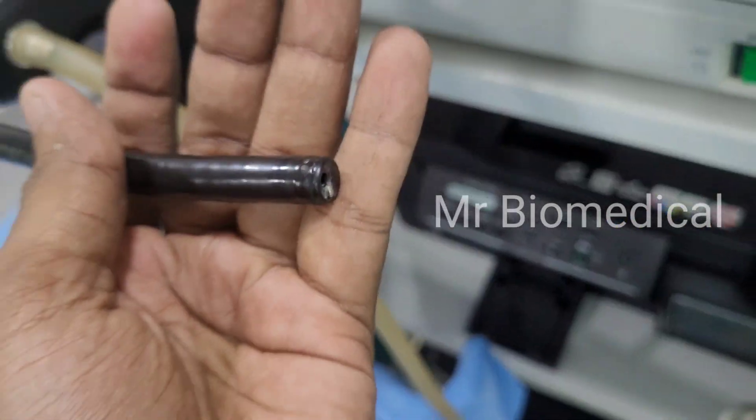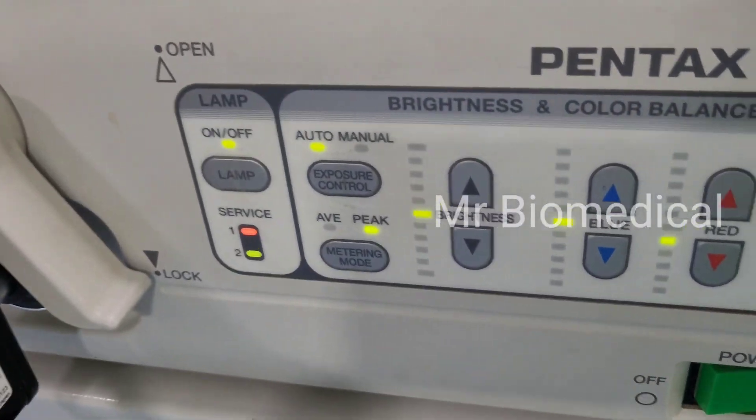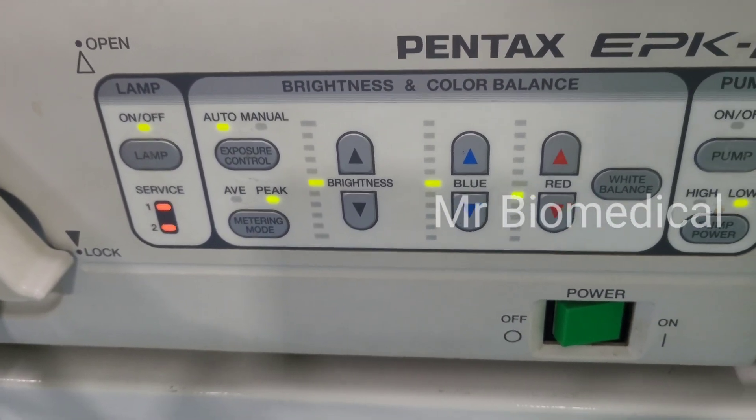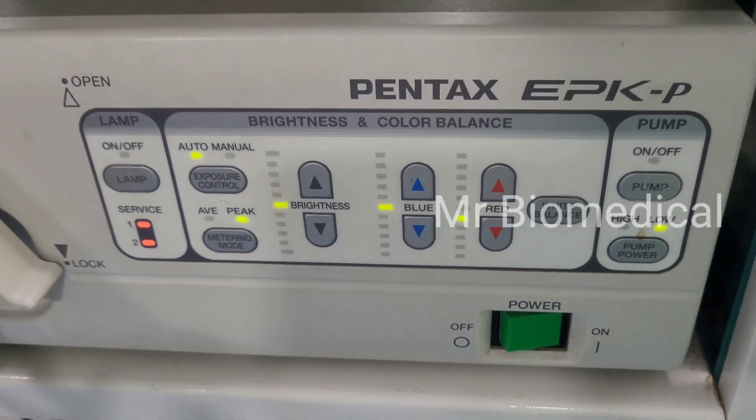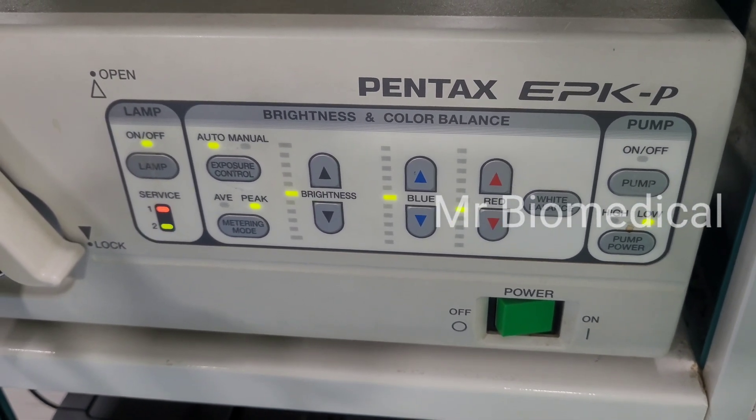This is the tip of the endoscope and the light is not coming, but the light switch is on. With the service indicator, two red lights are blinking.